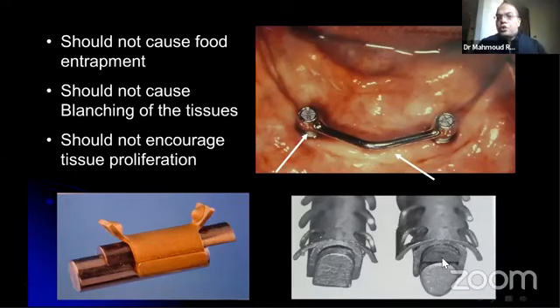Here we can also give a vertical movement for the bar by making a vertical spacer like this when we make the functional pickup, as we said in the last lecture. The vertical spacer is put between the male bar and the metallic sleeve to be removed later, and we will have a vertical space that allows up and down movement.